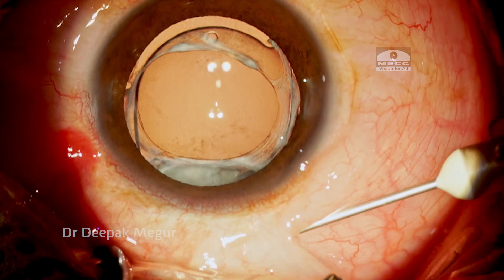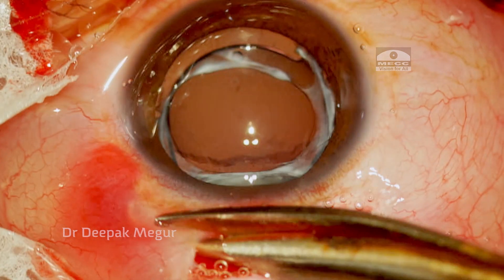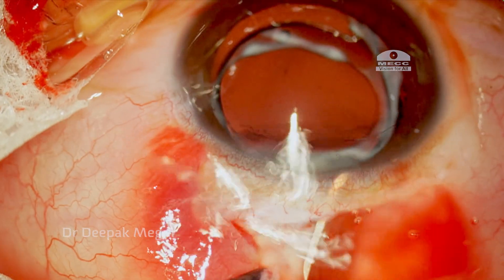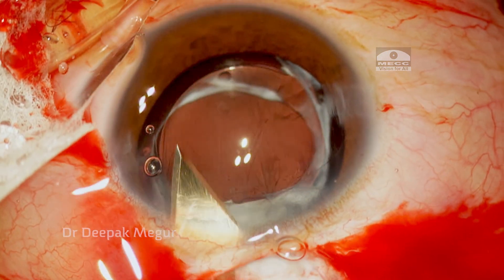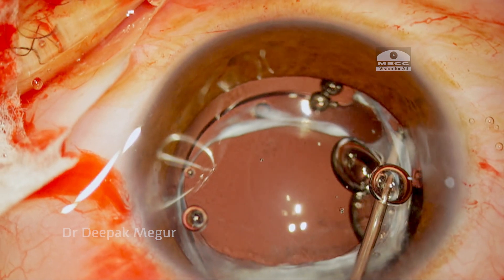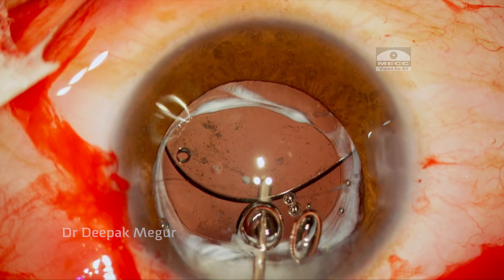I begin by injecting subconjunctival lidocaine in the superior quadrant, wherein I plan to create a superior sclerocorneal tunnel incision. A 6 mm sclerocorneal tunnel is created, and then the anterior chamber is entered using a sharp keratome. The internal lip is enlarged. I am using cohesive OVD to create some space within the bag, and using two Sinskey hooks to check for the mobility of the intraocular lens by gently rotating it. I was pleasantly surprised that freeing the lens from its attachment with the bag was not difficult at all.